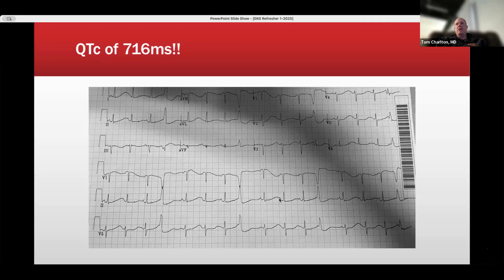Now think about it. All of these occurred while she was up and doing stuff. Well, guess what happens when you're up and doing stuff? Your heart rate goes up, which means these P waves are going to be happening more and more. So any kind of exertion was going to throw that P wave back into the T wave and cause her to go into VFib. So super, super, super important that we get 12 lead EKGs on anybody who's lightheaded, dizzy, I'm going to pass out, I might pass out, I did pass out, that kind of thing, because we're going to catch one of these days.